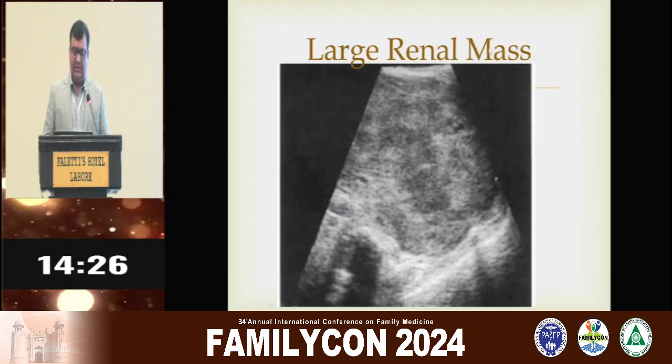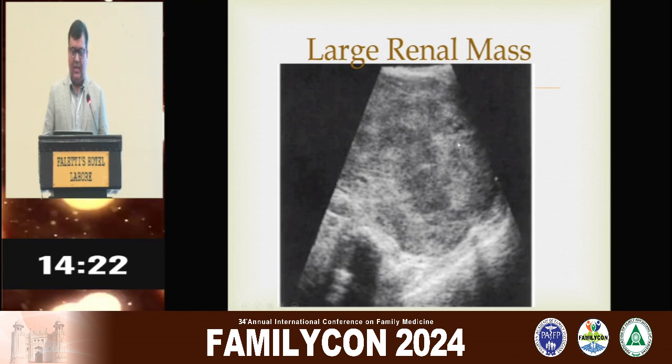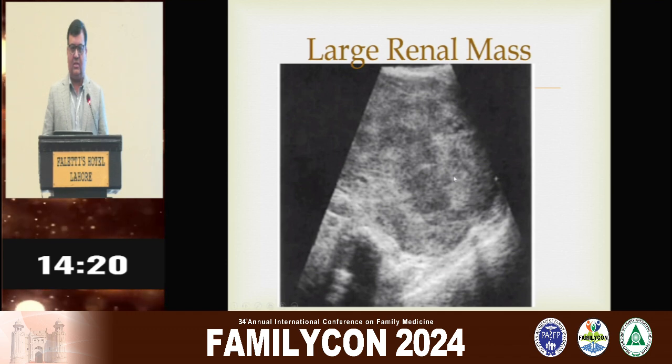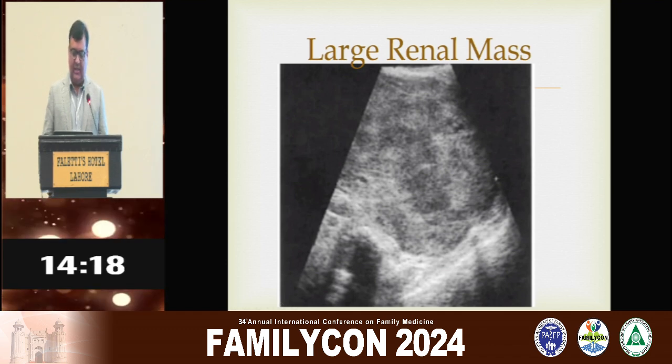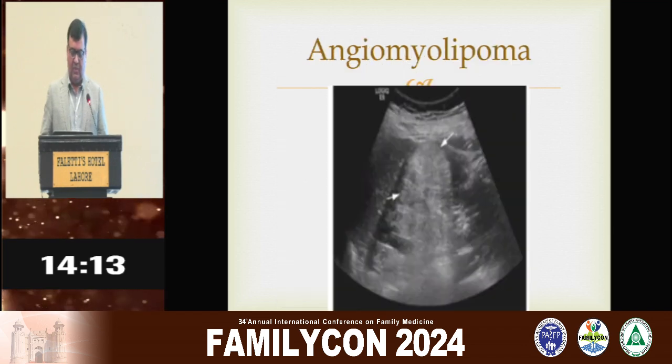This is another example of a mass where the mass is replacing almost everything, and you can see a heterogeneous structure which is not following the normal anatomical pattern of the kidney.